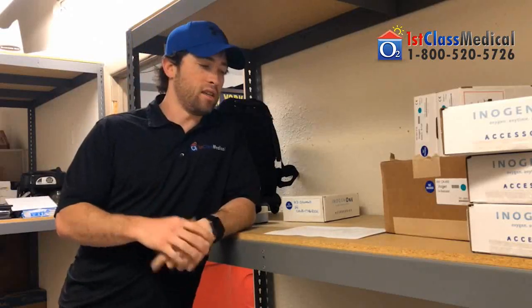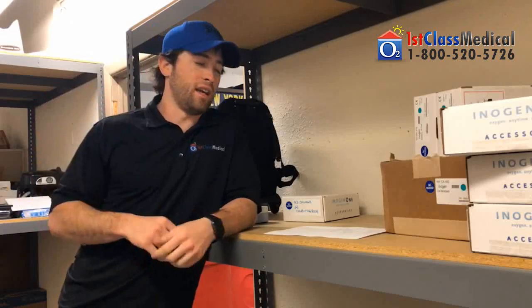This is what we do here. We'll have you walk back and forth for 5-10 minutes, then sit you down. This is now with the oxygen on. We look at your oxygen levels, and if you're saturated and above 88%, then that's good. We had you do some working out, and the pulse flow kept you up. So you definitely want a pulse oximeter with any of these concentrators. If you're on oxygen, you really should have one.